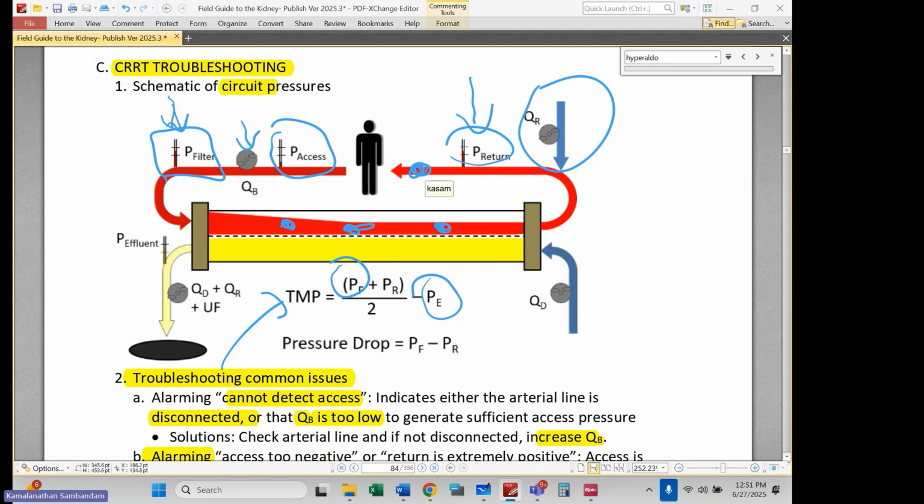the transducer is, you've got to know your transducers, I guess. I don't have a picture of them. The return transducer is next to your air trap. So as long as you're clamping the line before it's going to the patient, it's post return transducer. Okay.